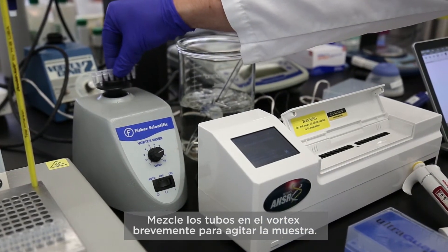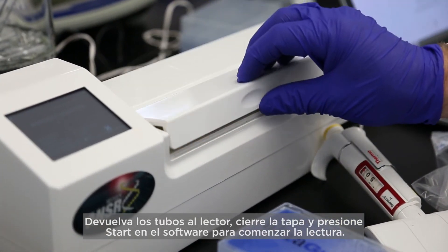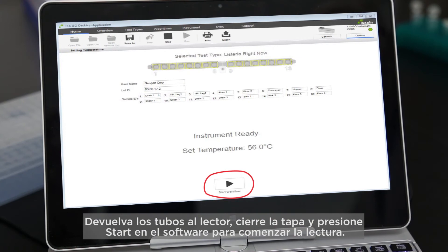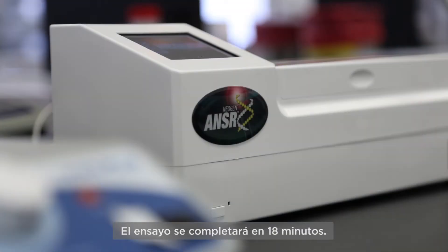Vortex the tubes briefly to stir the mixture. Return the tubes to the reader, close the lid, and press start on the software screen to begin the reading. The assay will be complete in 18 minutes.